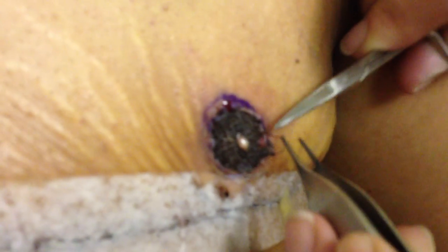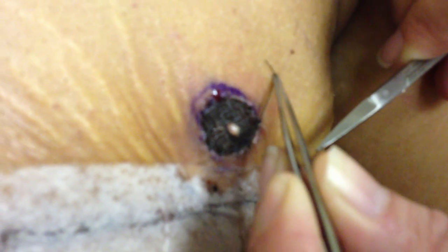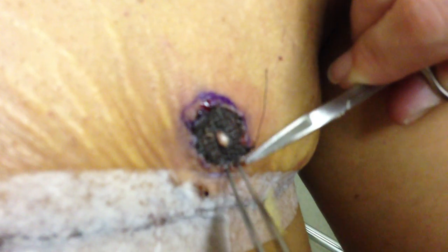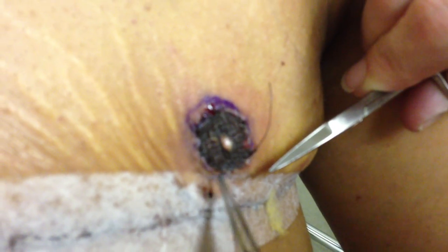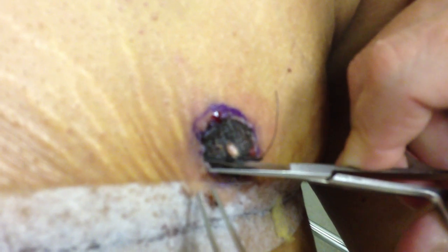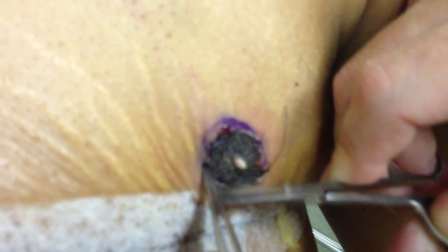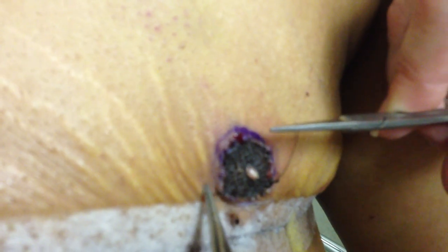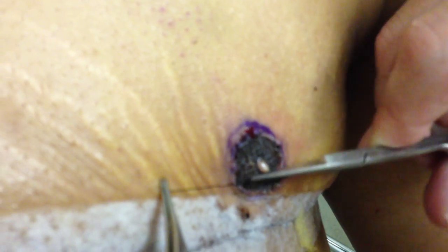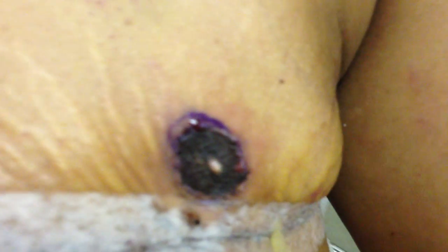You can see a little bit of it, and if it does happen to leave a little piece in, it's not the worst thing. I'll just give it a little pull — and sometimes this is where they feel a little bit of pressure. A little bit of oozing at the top is not uncommon either; it just indicates good blood supply. You can see the way this is running all the way around it, and I'm pulling this out — now there's absolutely nothing left in there.